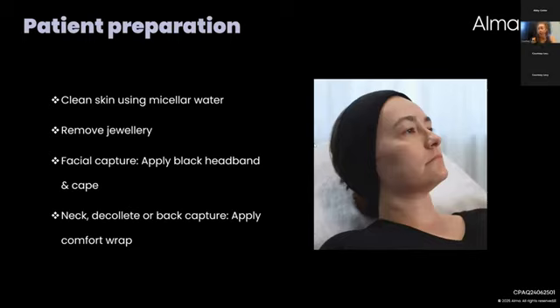So regarding patient preparation, ideally the patient will come to the clinic without wearing a lot of heavy makeup, and then in this way they can clean their skin with micellar water. This is the best product to prepare the skin for the imaging. We then want to remove any jewelry, earrings, necklaces, and very importantly, we have to use the black headband and cape that's provided with the system to block out any light.